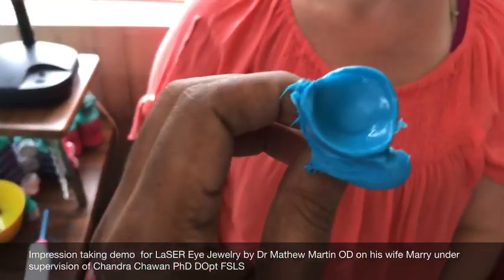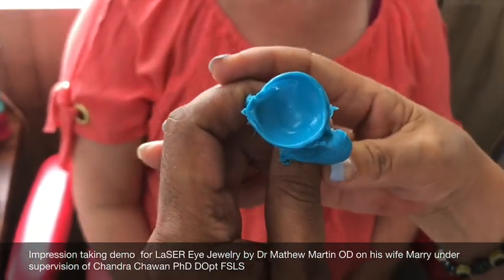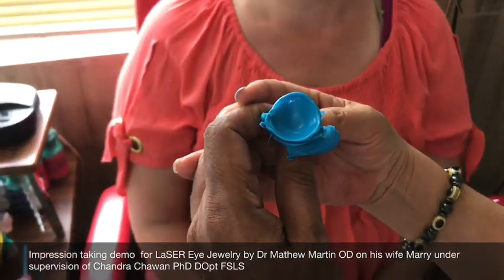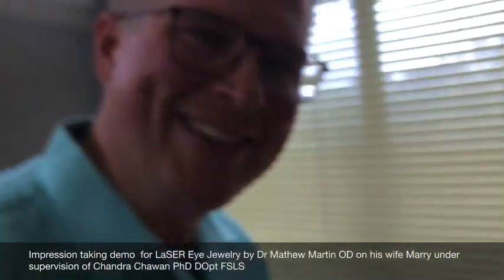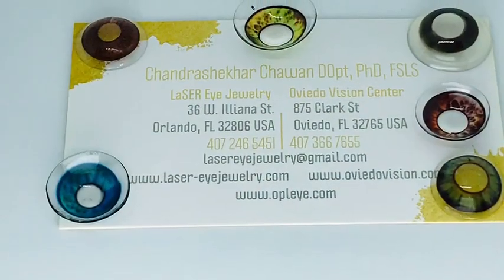How did that turn out? I got the flat on top — this is very nice, wonderful, fantastic. Did a little better job on that second one — you're certified! Certifiable! Thank you, this is Dr. Martin. We were doing scleral lenses from an impression today here in Mumbai with Chandra, and I want to thank everyone for taking the time to watch, thank you.